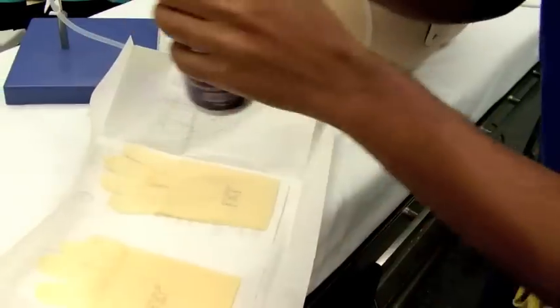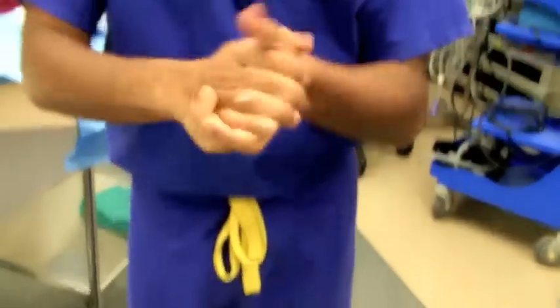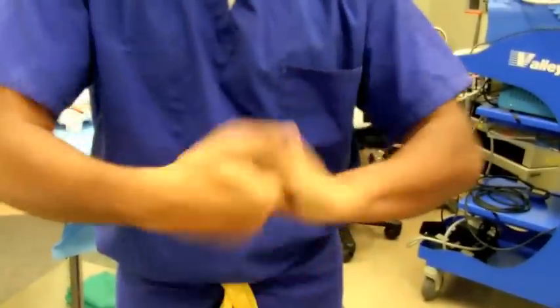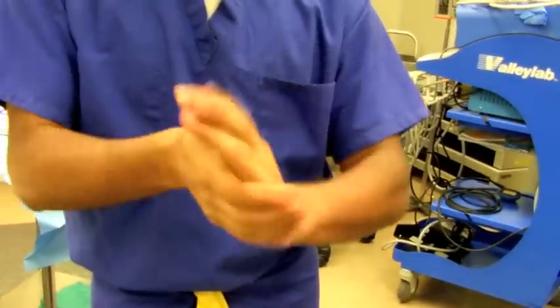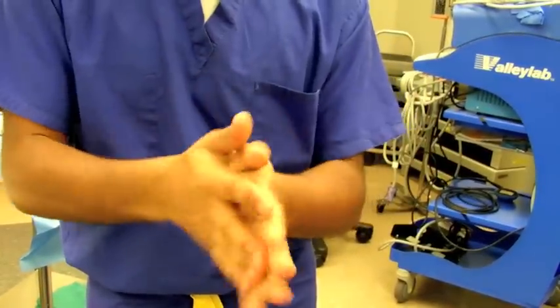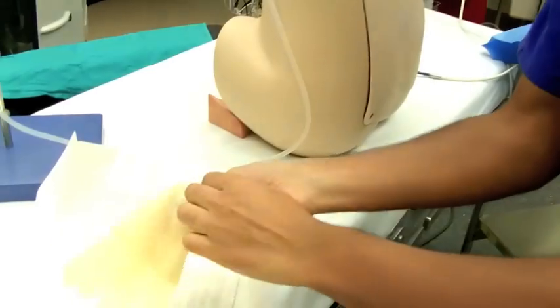I'm going to wash my hands with gel. Once dry, I'll put on my sterile gloves.